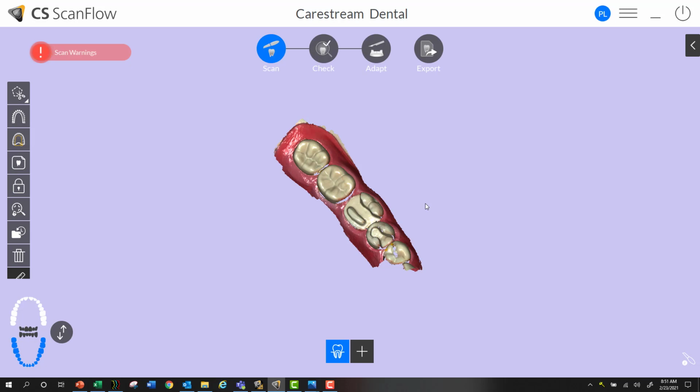The only downside to having that remove soft tissue turned on is if you're scanning large edentulous spans of smooth tissue, or if you're scanning a denture to duplicate the denture, or you're scanning the palate, often it gets a little bit too aggressive. And when you're scanning, you'll actually see the data. You think you're scanning it, you see the data there, and then it will delete it because it's being a little bit too aggressive with that remove soft tissue. But for the other applications, it actually works really, really well. And your scan will simply be cleaner while you're scanning in the scan step.